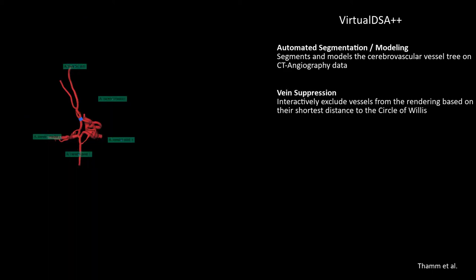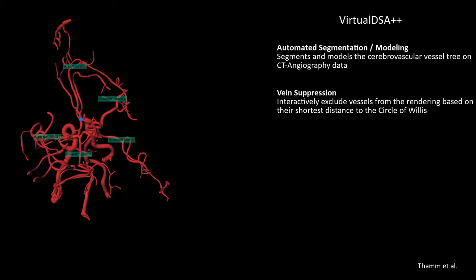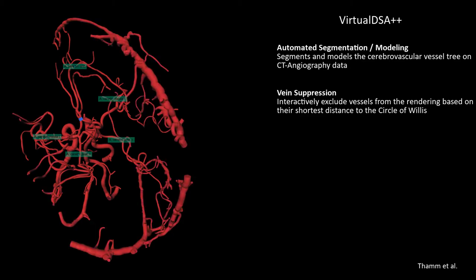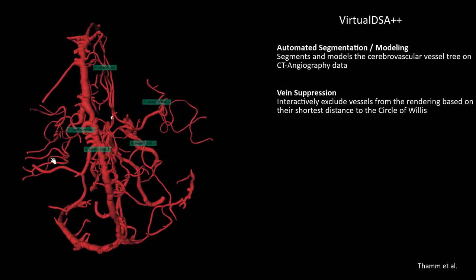It also allows to exclude veins from the rendering based on their shortest distance to the circle of Willis. This feature is called Vein Suppression. The blue cube in the center indicates the root node where the vein suppression relates to.